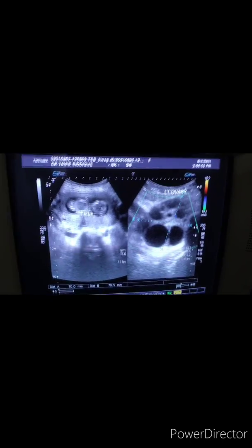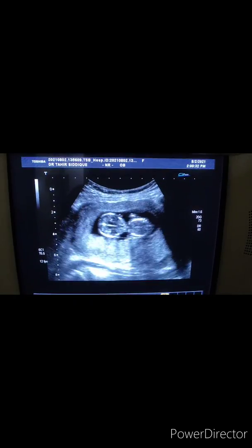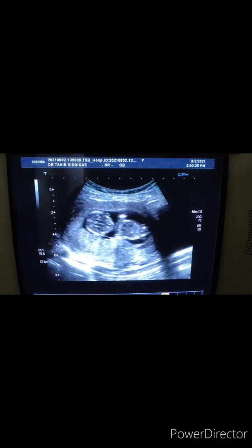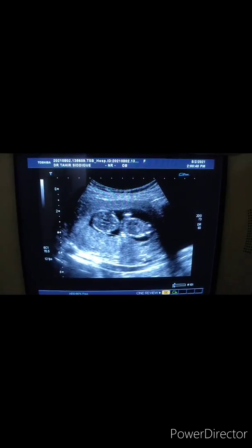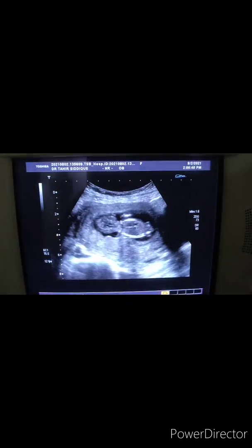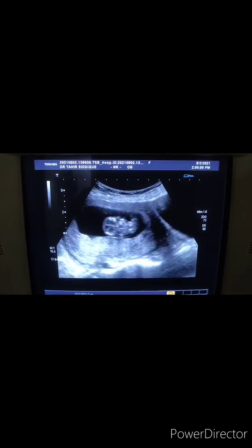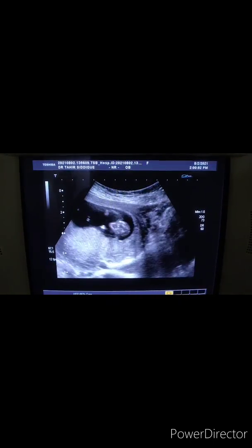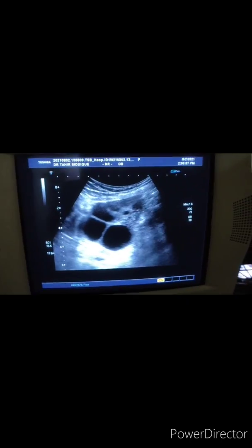This is the case of the day. Now let's go on in real-time to show you the same. See the fetus — this is the fetus. Now I'm going to show you the other multi-cystic ovary with large cysts.